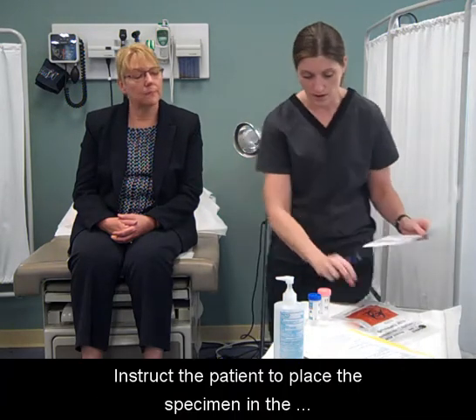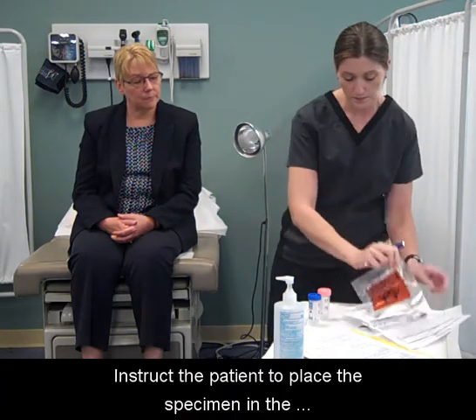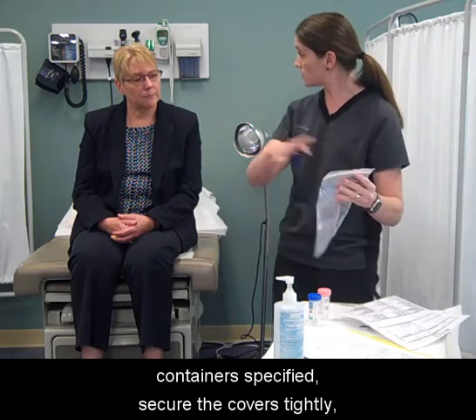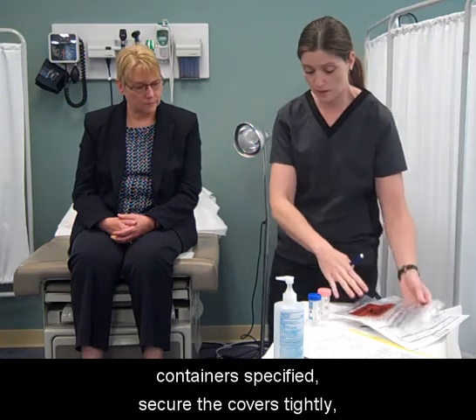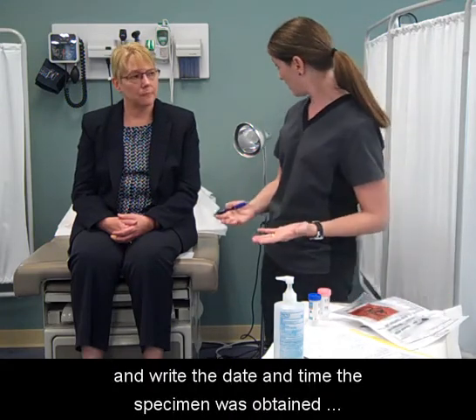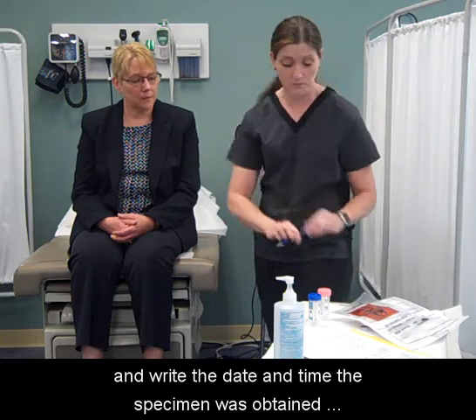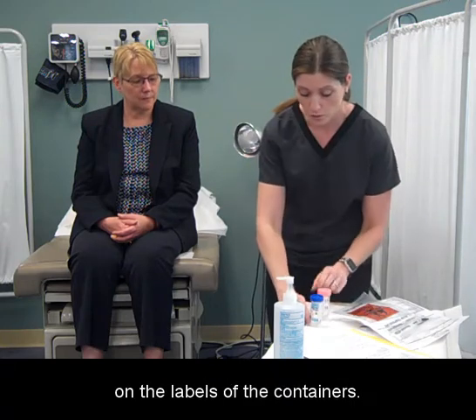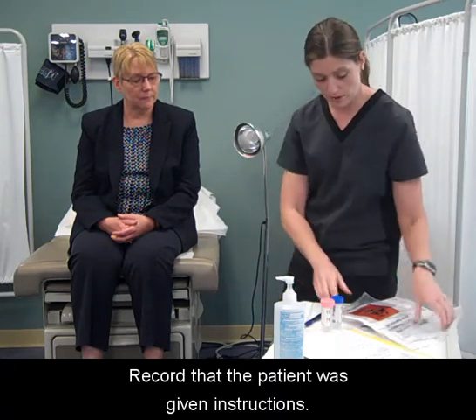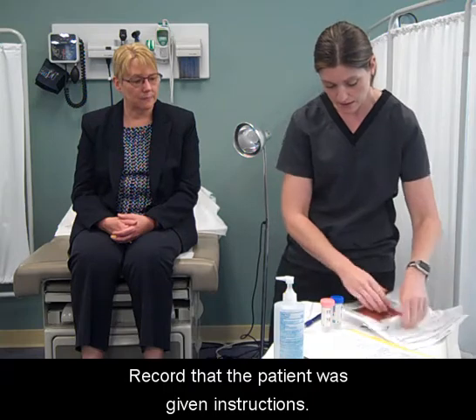Instruct the patient to place the specimen in the containers specified. Secure the covers tightly and write the date and time the specimen was obtained on the labels of the containers. Record that the patient was given instructions.